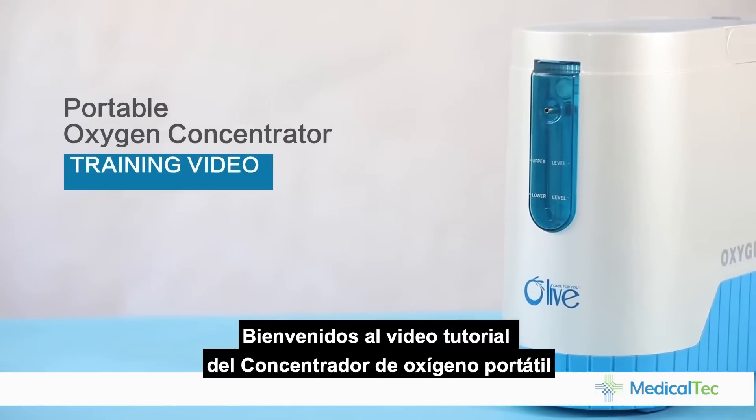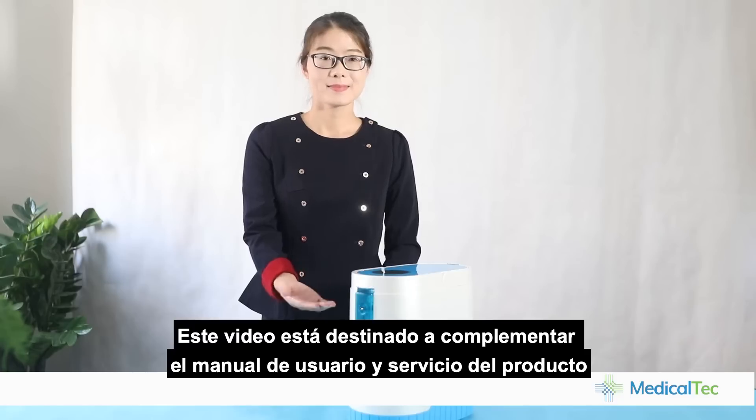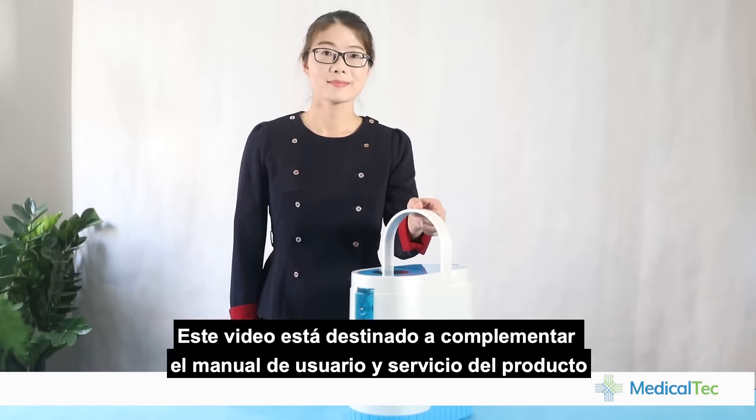Welcome to the Portable Oxygen Concentrator training video. This video is intended to supplement the product user and service manual.